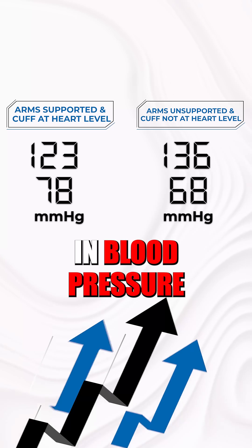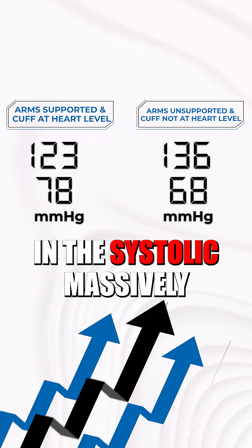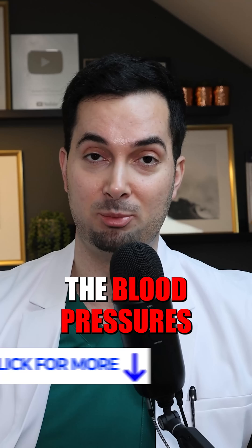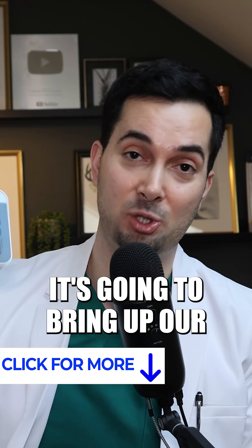It's really important that we're in the right position and feeling supported when we're doing a blood pressure reading, so that we don't get an artificially elevated or inaccurate result.